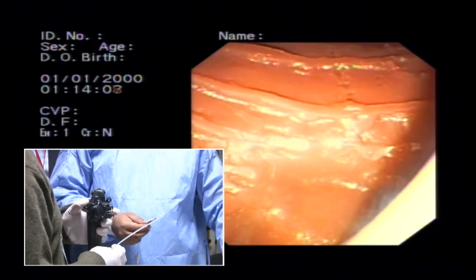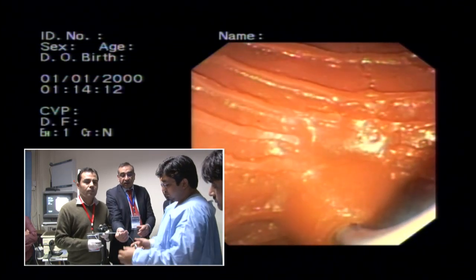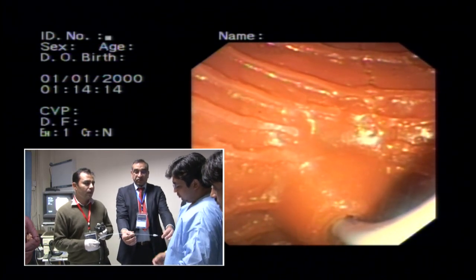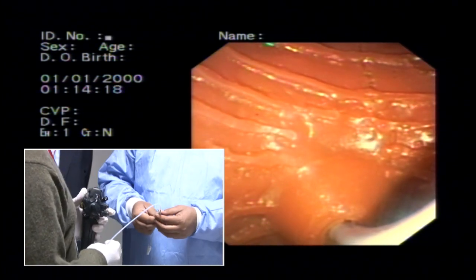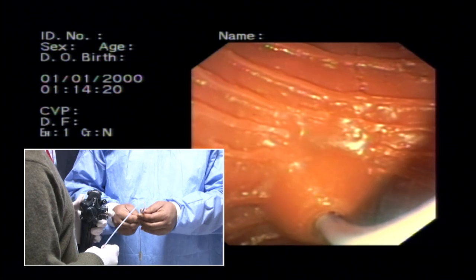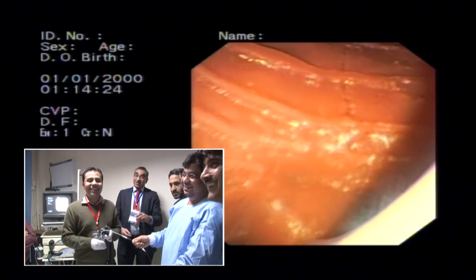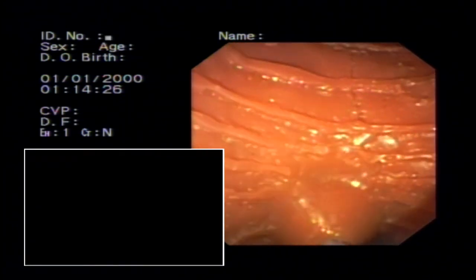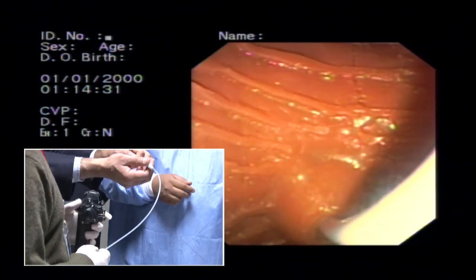मीनवाइल वसीम नीचे वाली शीट को थोड़ा सा टेंशन दे के इनको स्ट्रेच करो। आप अपने असिस्टेंट को कहेंगे कि इसको ऐसे स्ट्रेट लाइन में रखिए, थोड़ा सा फुल बैक हो। वसीम को पता ही है what to do, लेकिन हर जगह वसीम मौजूद नहीं होता, वहां पर आपके जो असिस्टेंट होंगे उनको आपने कहना है कि इसको स्ट्रेट रखना है, क्योंकि अगर ये टेढ़ा जाएगा फिर it wouldn't do anything.